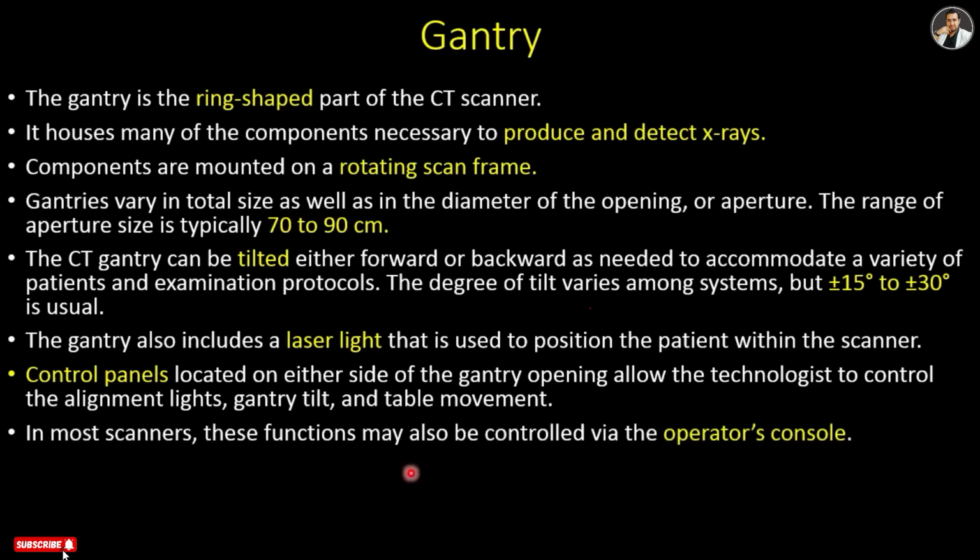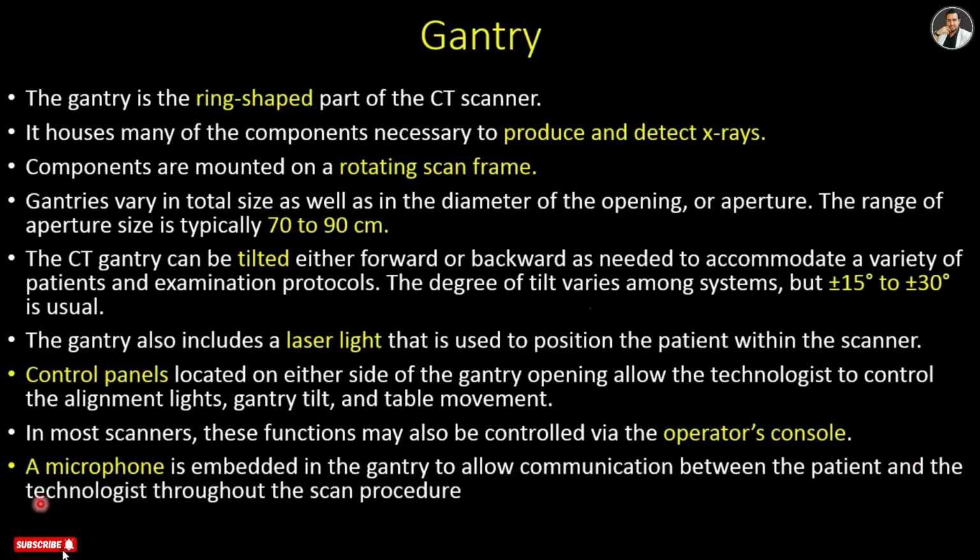In most scanners, these functions may also be controlled via the operator's console. We can control the machine by pressing the buttons on the operating console. A microphone is embedded in the gantry to allow communication between the patient and the technologist throughout the scan procedure.